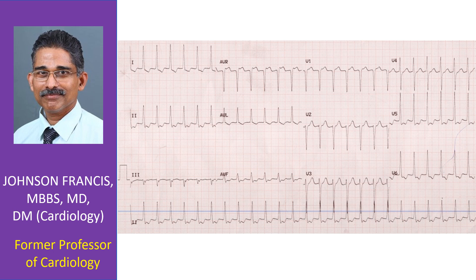In this case, no features of flutter waves are evident. Instead, there is a suggestion of a retrograde P wave at the end of the QRS in inferior leads. This qualifies for the description of short RP tachycardia. Two important differential diagnoses of short RP tachycardia are AVNRT and AVRT.